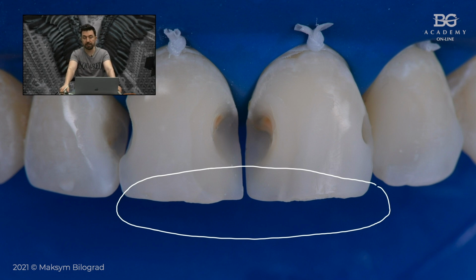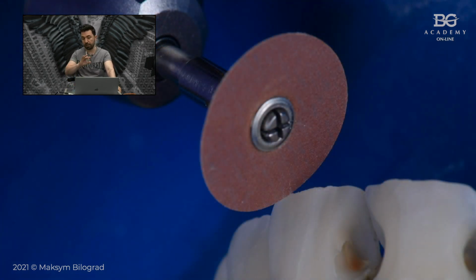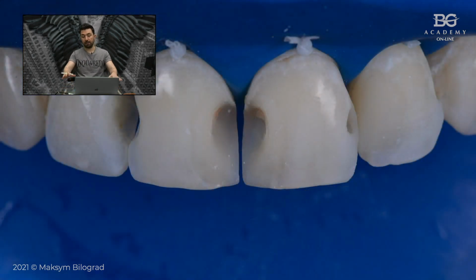So everything that is inside has to be very smooth and rounded. One of the best options in such cases is to utilize a disc or a rubber point just to smooth all enamel where you will add your composite. So now you can see it slightly rounded and smoother, so we are happy not to have white lines later on between our restorations and teeth.